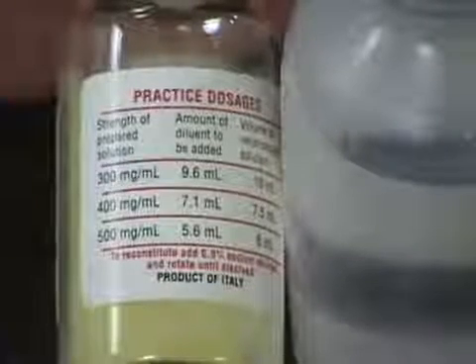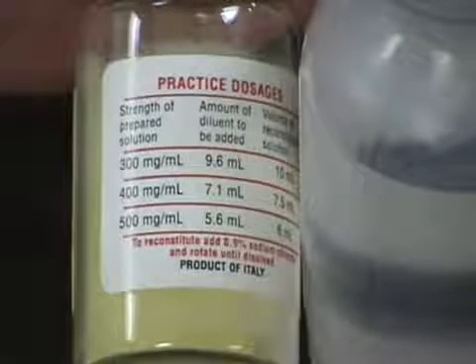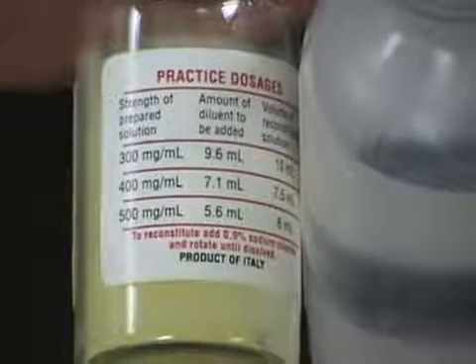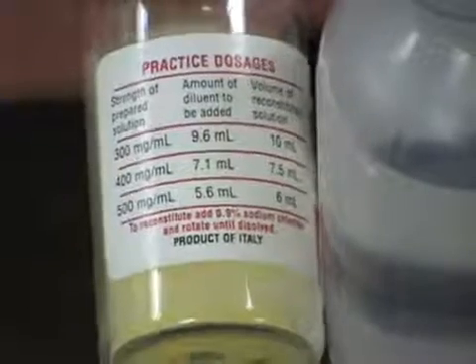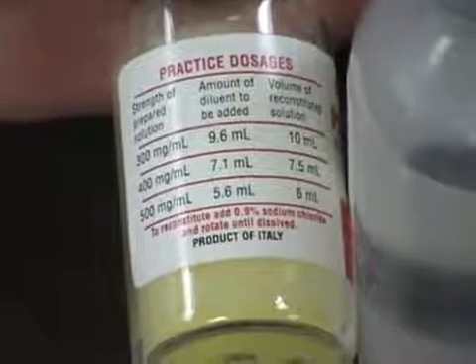The medication is in powdered form. I need to reconstitute it in order to draw it up. The patient has been ordered to receive 500 milligrams of the medication. I will look at the column on the vial for the strength of the prepared solution, noting that my patient is to receive 500 milligrams per ml. The amount of diluent to be added is 5.6 ml of normal saline to the vial, which would give me a prepared reconstituted solution of 6 ml of fluid, for a final concentration of 500 milligrams per ml.